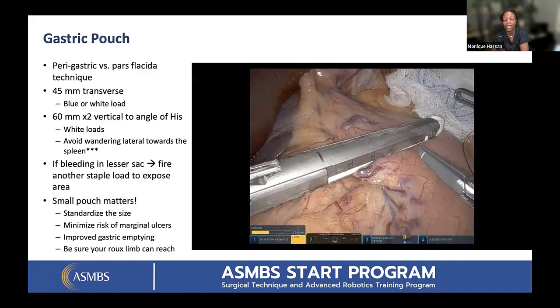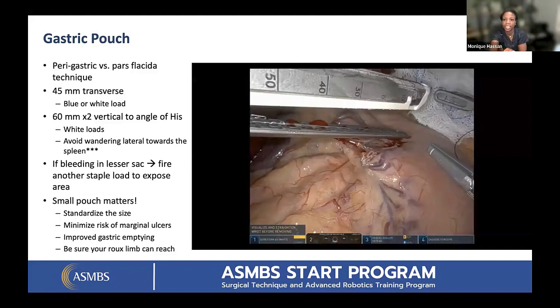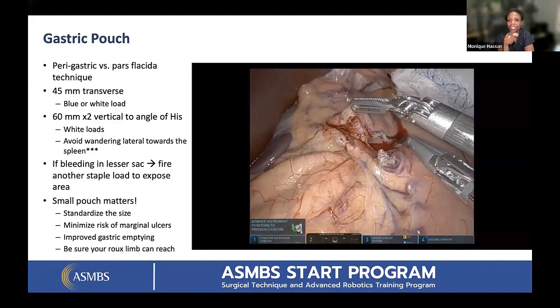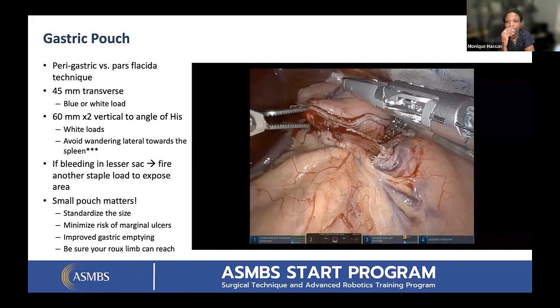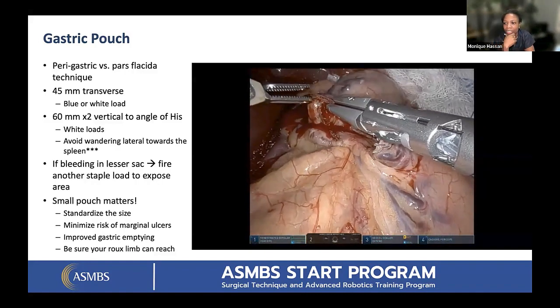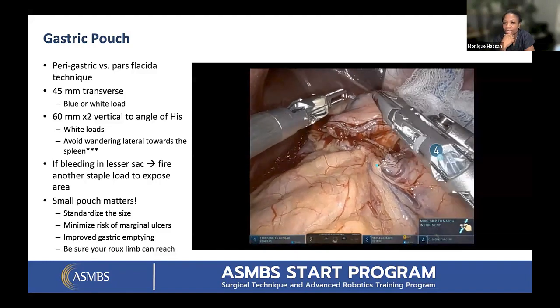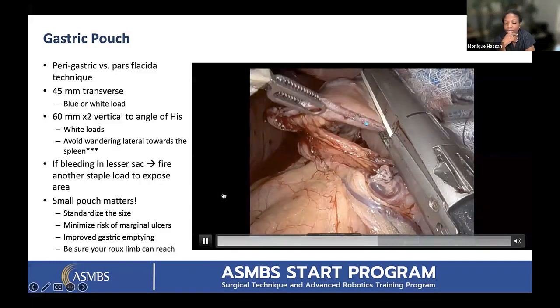What I actually do is I have anesthesia put the bougie. I use a 40 French Visiglide. I have them put it all the way down, almost like a sleeve, and it helps to extend the stomach and lay it out flat. So then I can clearly see those veins. And then I take that descending branch that you have right there with the vessel sealer. Before I even start my pouch, I actually mobilize the angle of His first, just so that I can expose my left crus to look for a hiatal hernia. So that's another option, I think, when you're creating your pouch, just to make sure that you're right there on that left crus.